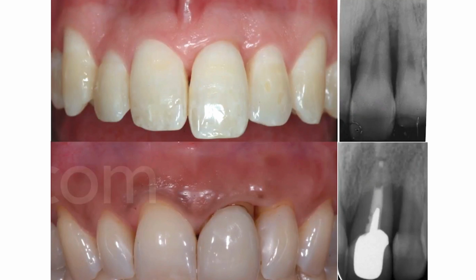Same story in regenerative therapy. We may have very, very similar conditions, yes? In this condition, the two teeth are so close, but there is a soft tissue isthmus between the two roots. In these teeth, the distance between the roots is exactly the same, but there is no soft tissue. So what is the difference between these two? This can be treated with the regenerative procedure. In this case, one of the teeth has to be extracted.